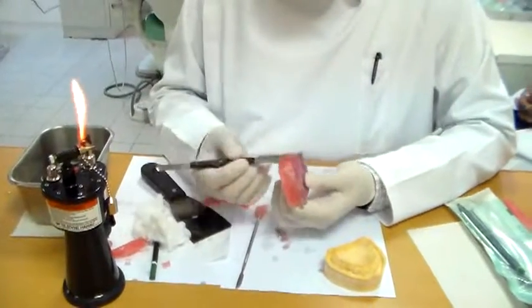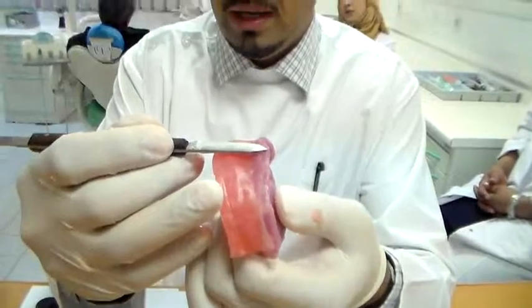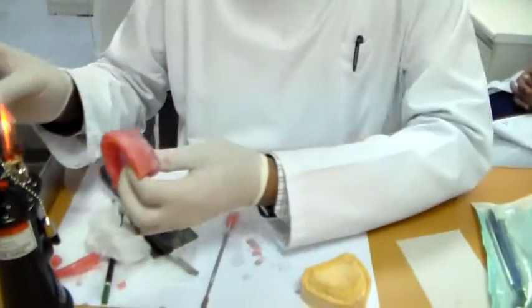So here you definitely want a straight plane. Definitely want a straight plane. You don't want the space here, so you want to fill up this plane to get a smooth surface. So just fill it up with some wax.